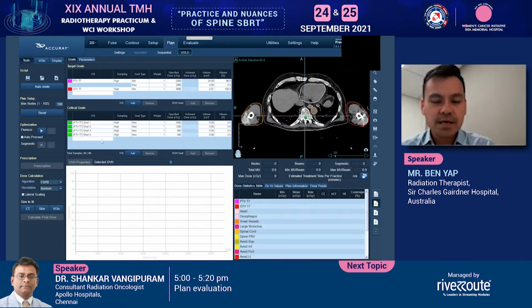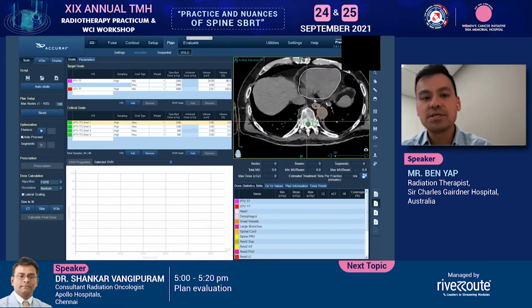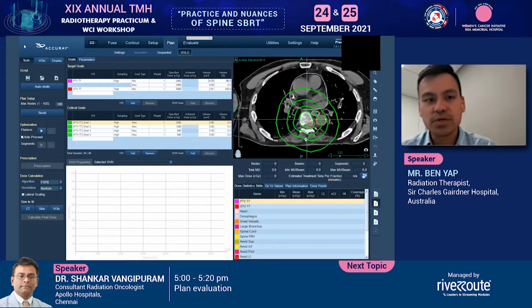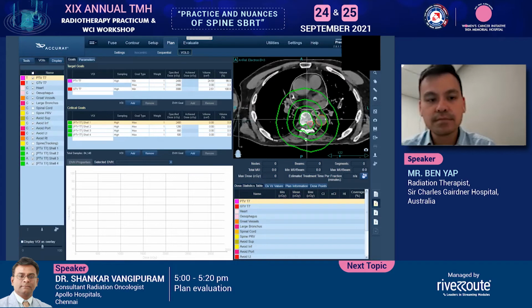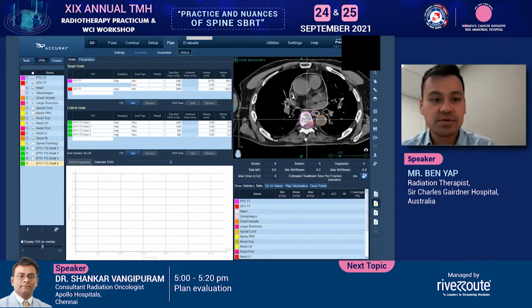Now you can see we've got everything in high sampling, 84,000 sample points. That's fine. That's actually very low. But I also want to, as you can see in this plan, put goal constraints on all these organs at risk. So what do we need to consider? Well, the organs at risk that we need to consider are, as discussed, the heart, the esophagus, the vessels, and spinal cord, obviously, which I should really put on.